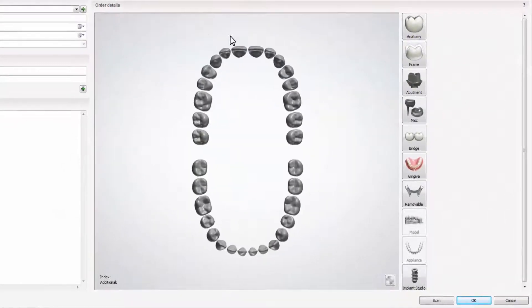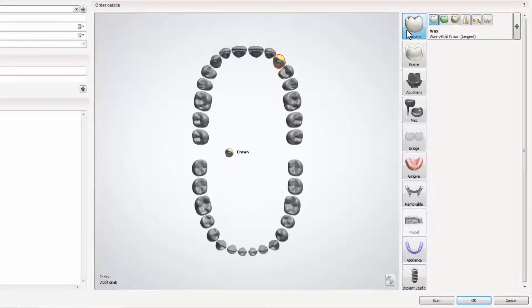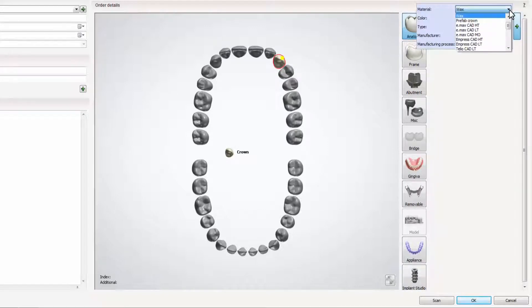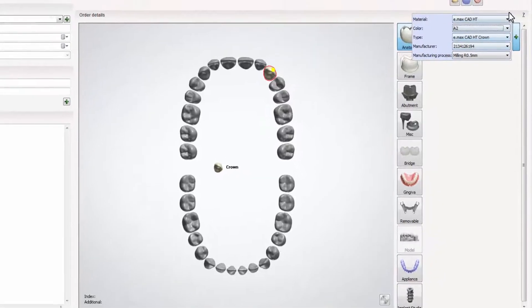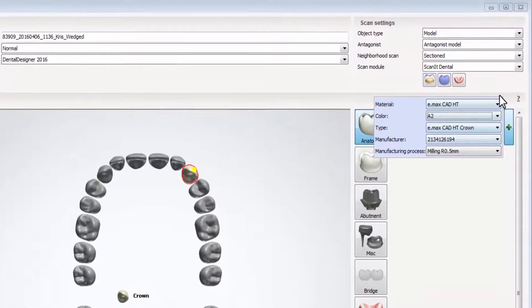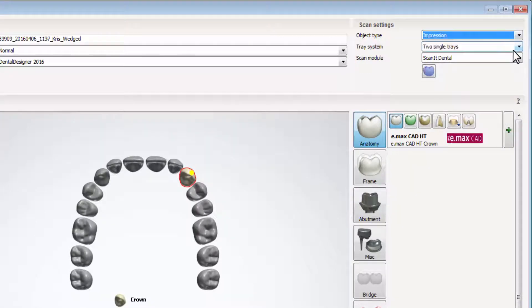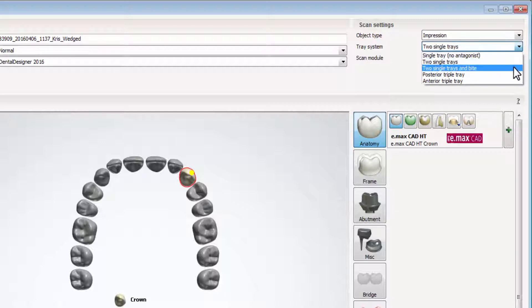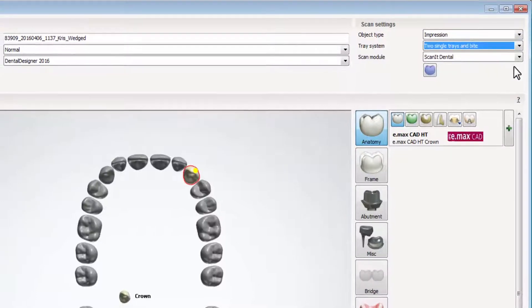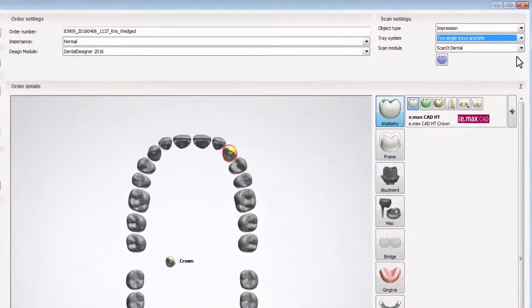Start with order creation. In the order form, select the tooth and on the indications list the type of restoration you wish to produce. Then in scan settings, change the object type to impression and in tray system, select the tray type that you are going to scan. In our case, it will be two single trays and a bite.